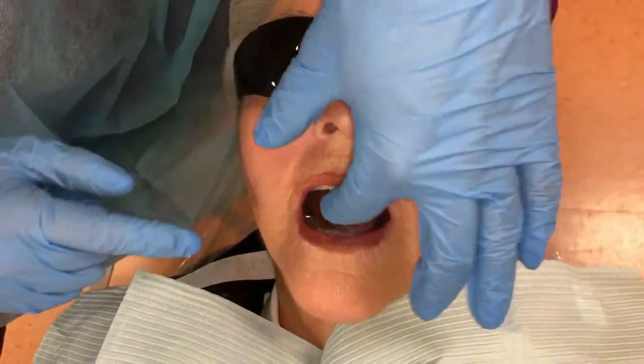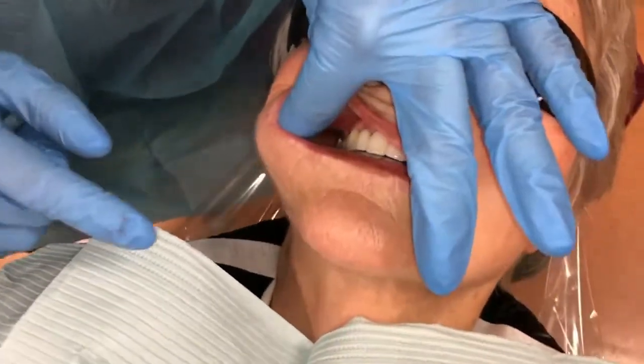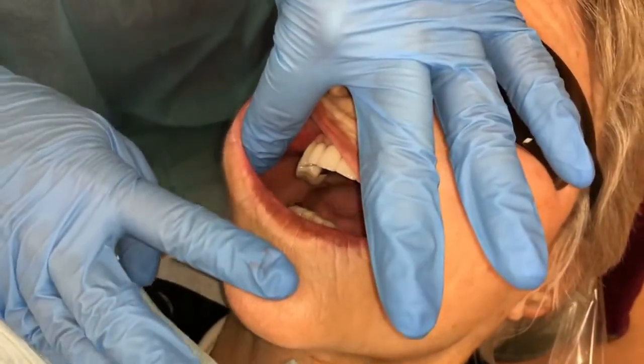Determine the location of the target point. Pull the upper lip with a dental mirror. Treat the injection site with antiseptic. Perform applicational anesthesia. Take a carpal syringe with a needle of 41.5 mm.